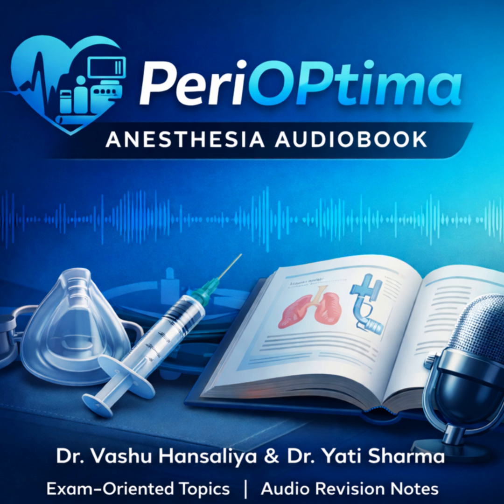Before we get into the actual modes that use these controls, let's dissect the breath cycle. The books talk about three phases: trigger, limit, and cycle. These terms can get a bit jumbled. They can, but think of it as the life story of a single mechanical breath. It has a beginning, a middle, and an end. So the trigger is the beginning. The trigger is the start button, what initiates the breath. Is it the machine's internal timer going off? That's a time-triggered breath. Or is it the patient making a little effort, creating a drop in pressure or a change in flow? That's a patient-triggered breath.